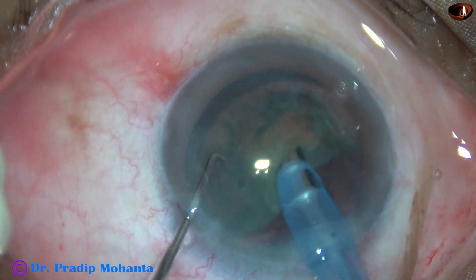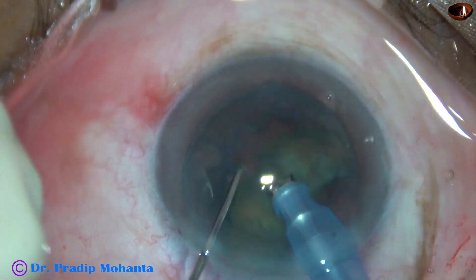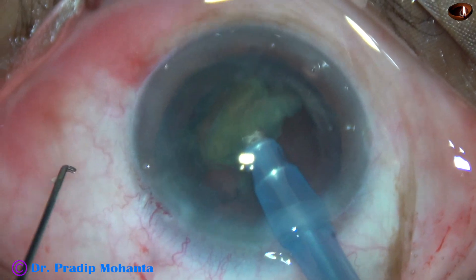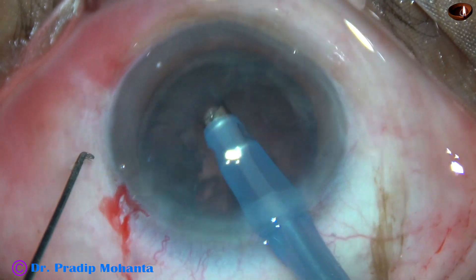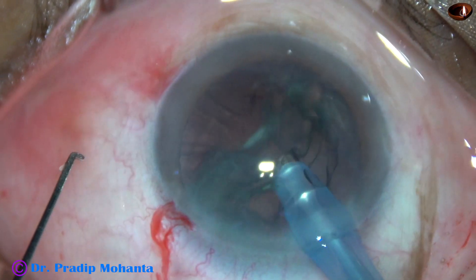Each nuclear fragment is emulsified immediately after chopping in such routine soft cataracts. But in hard cataracts, we should chop all the fragments first and then start emulsifying the pieces.